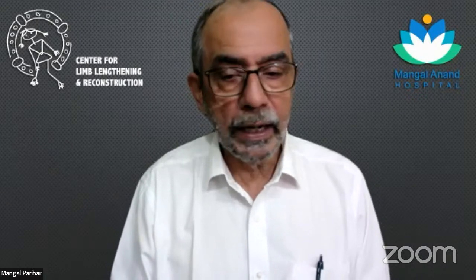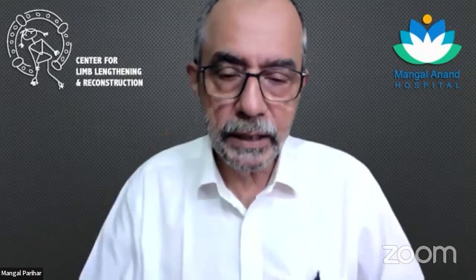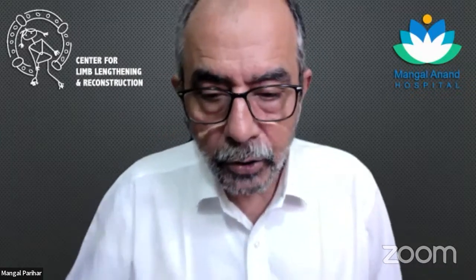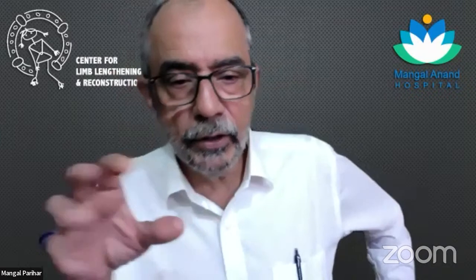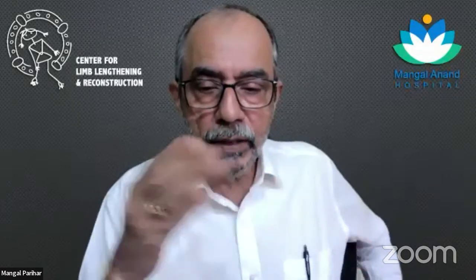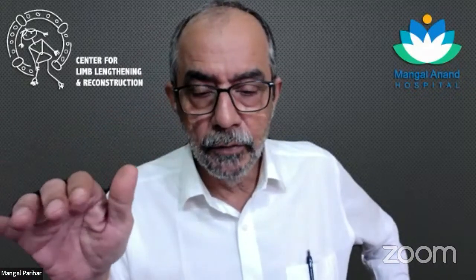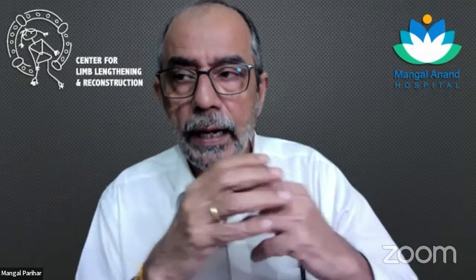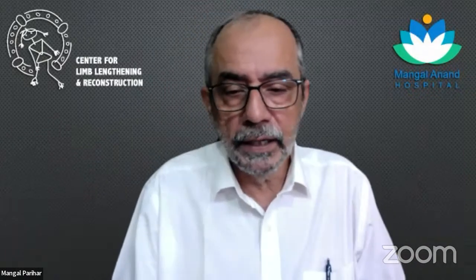The fixator will tend to get loose over time. The patient is not going to tolerate the fixator for 5 or 6 months. So I think both of these things should not be mixed up. For acute correction, you should have some form of internal implant, whether you're doing an open wedge or a closed wedge. The only situation where you can do acute correction with a fixator is, say, with an Ilizarov and a dome correction, where you've got good stability and you expect that this is going to heal in three and a half months, by which time the fixator can be removed.